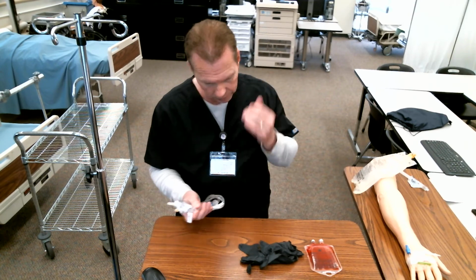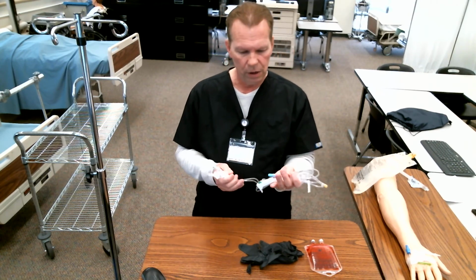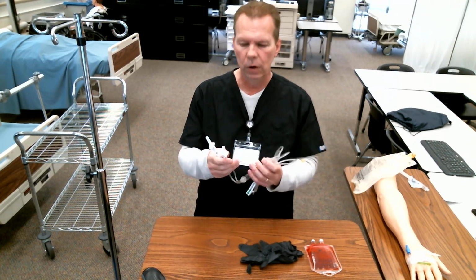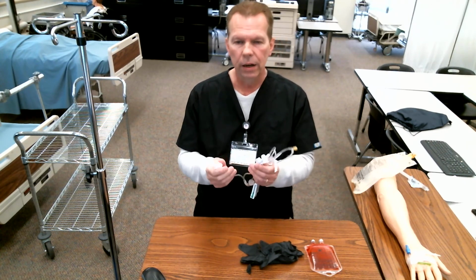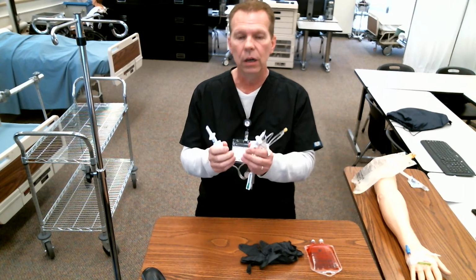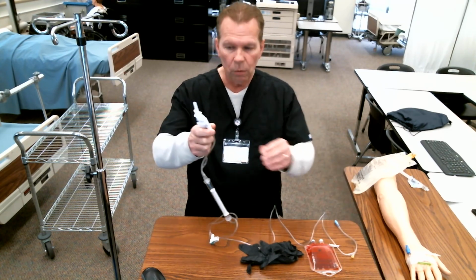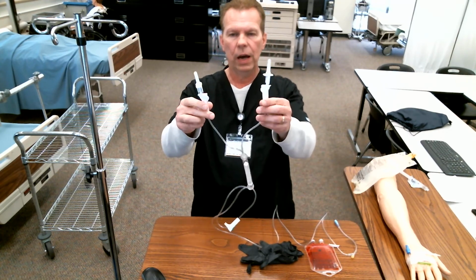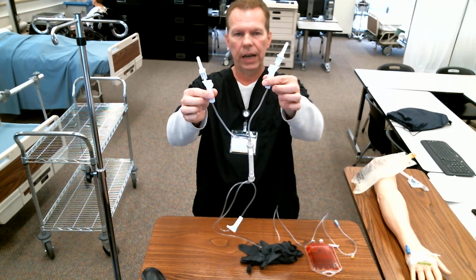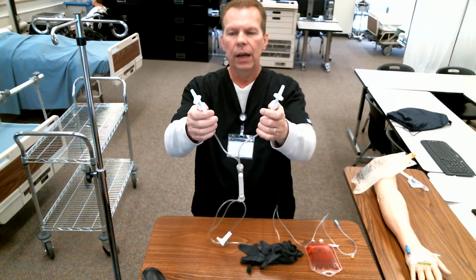And as with IVs, the first thing that you need to do when you get tubing out, any kind of tubing, I don't care what it is, it's going to be wide open. So the first thing you want to do when you get tubing out is close off the regulator. Okay, in blood Y tubing, the reason they call it Y tubing is because it looks like a Y. When you hold it up, it actually has a place to spike saline and a place to spike your blood.